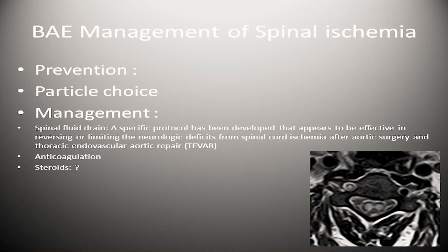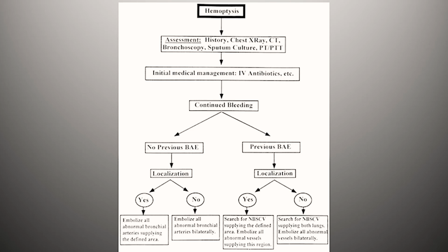If you see that artery back flowing, you need to be very cautious. Or sometimes you don't even see that and it happens, then you need to be prepared for all these things. That is something you need to tell the patient or family upfront, that this can happen. That protects you medico-legally a little bit. This is just a flow chart of how to localize and do all these things, but we talked about that.